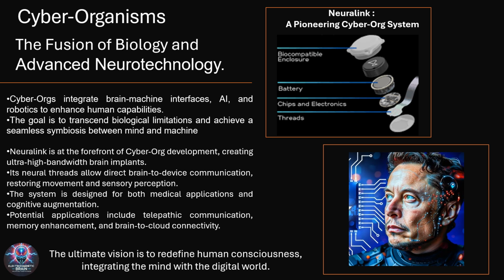One of the most ambitious pioneers in this field is Neuralink, a company dedicated to developing ultra-high bandwidth brain implants. Neural threads are designed to enable seamless communication between the brain and external devices, restoring lost motor functions, enhancing perception, and even unlocking new cognitive abilities. Neuralink's system is not merely a tool for treating neurological disorders, it represents the foundation of a future where humans can interact with technology. Looking ahead, Neuralink envisions a world where brain interfaces go far beyond medical applications.